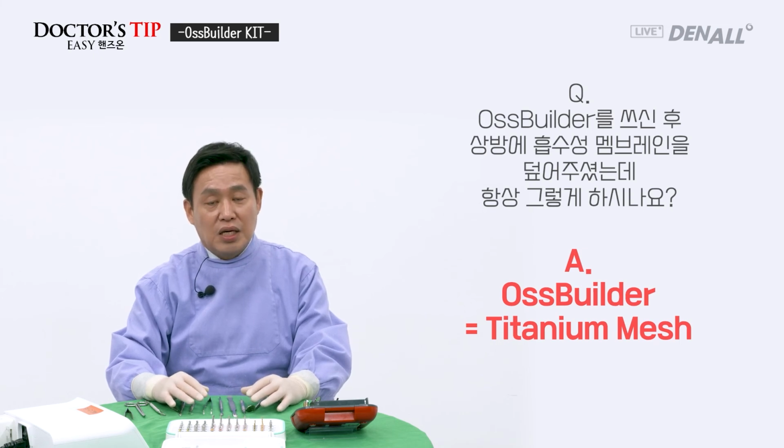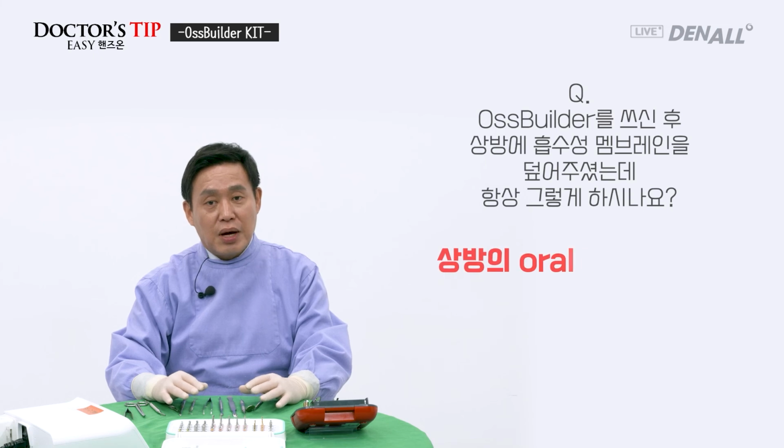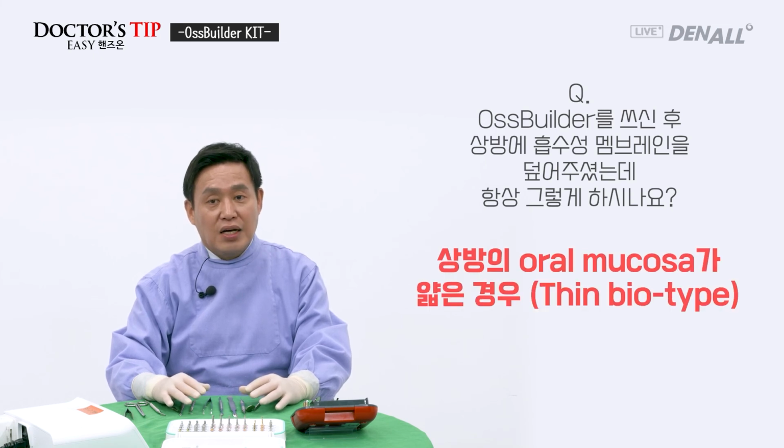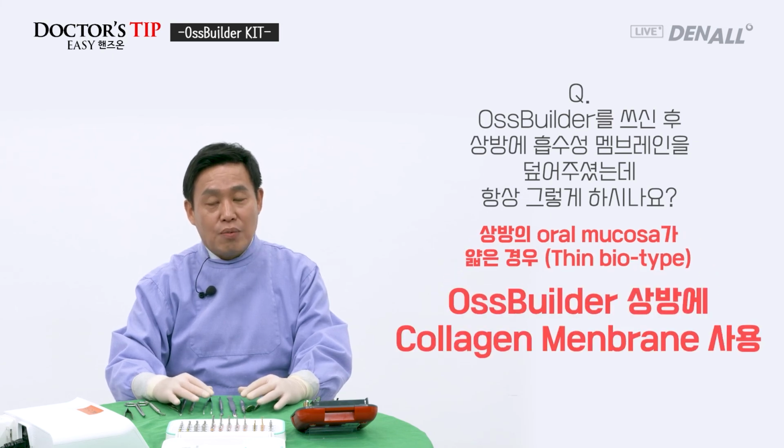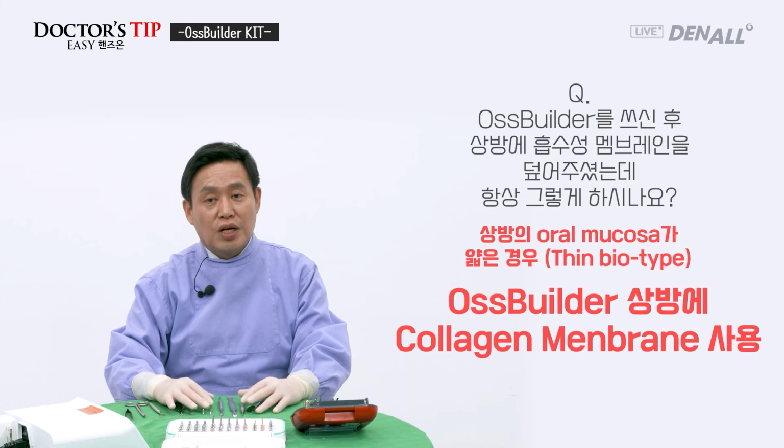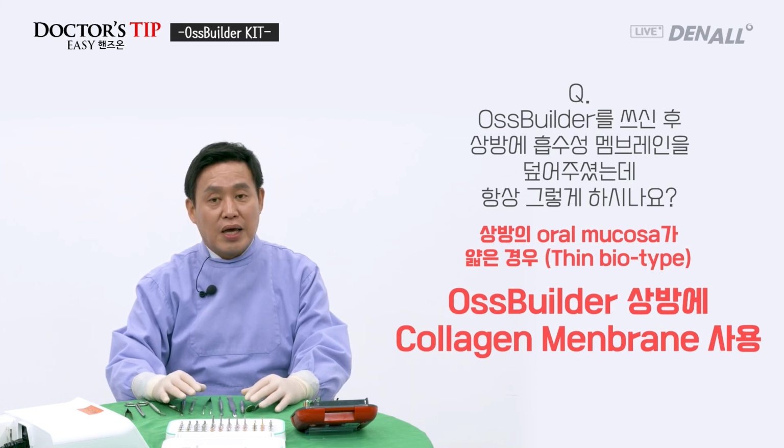There's no such function, especially in thin biotype, with the oral mucosa on the top being rather thin. I think it's better to use collagen membrane and other resorbable membrane so that you can prevent OssBuilder being exposed in the future, and you'd be able to gain more thick oral mucosa on the top. I tend to use a resorbable membrane on top of OssBuilder to do better wound management, and that is how I use it clinically.